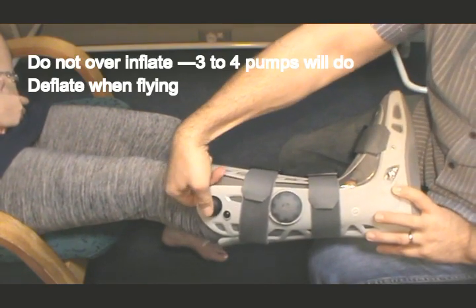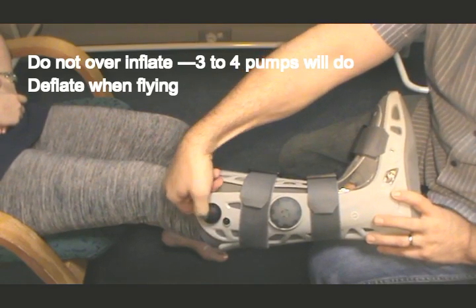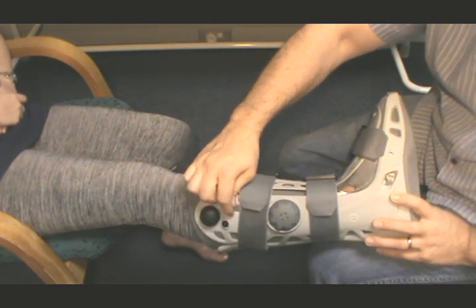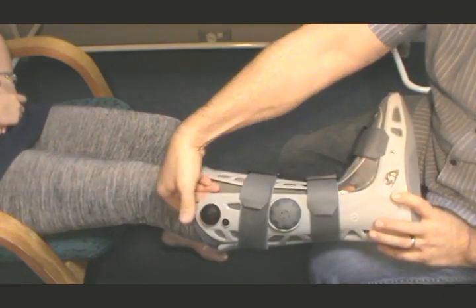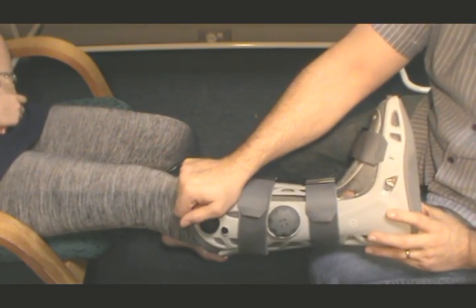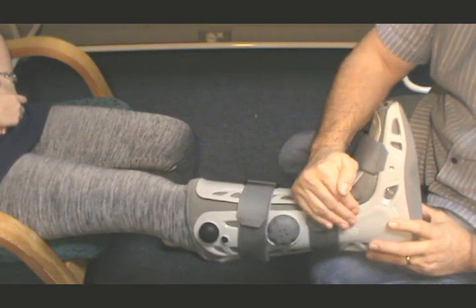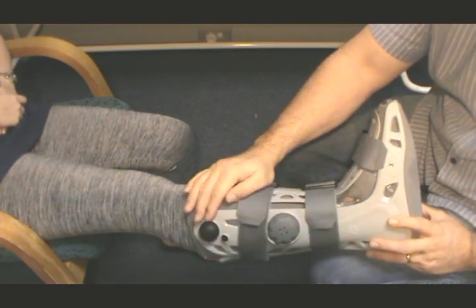So if you pump it like this, and you don't release it, it's not going to suck air back into this little pump. So you need to take the air, and the air has to move from this pump all the way down with tubes and into the bag. So you're going to go 1, 2, 3, 4, and what you want to really do is find a negative pressure. Negative pressure meaning is that when the patient is able to feel the pressure of the airbag, then that is enough pressure. You don't need to over pressurize the bag.